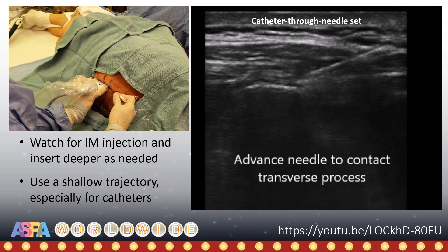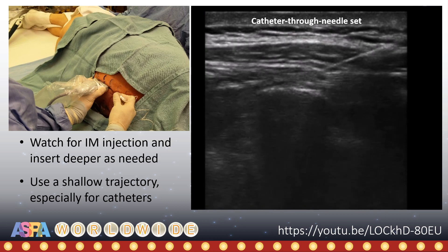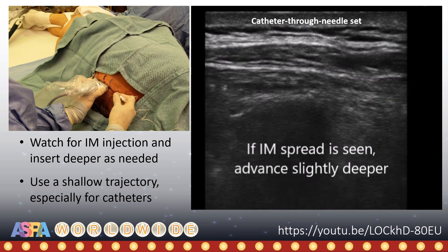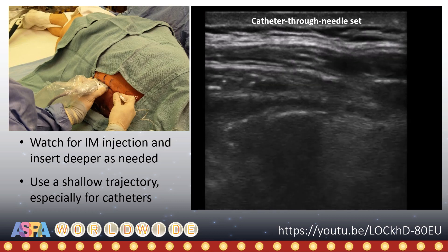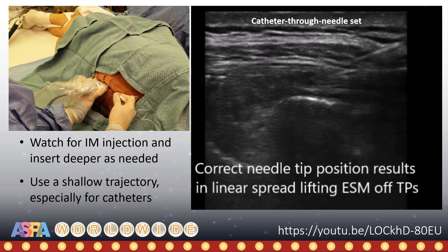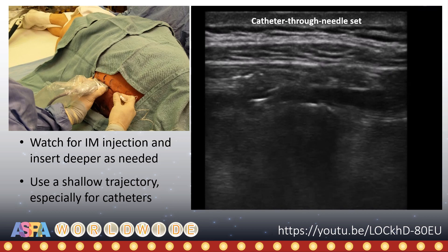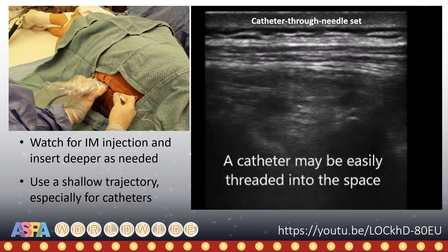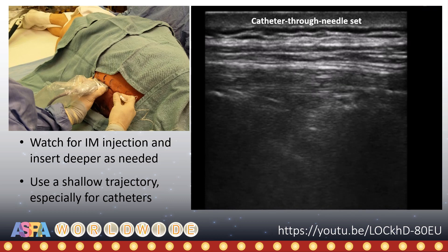Note how in thin patients, the muscle can be significantly compressed by probe pressure. As always, use hydrolocation and watch for intramuscular injection. If this occurs, insert deeper to get under the investing fascia and to obtain the desired linear spread that occurs in both a cranial and caudal direction and lifts the muscle off of the bony shadow. Once the space has been opened and the needle tip is within it, a catheter can be easily threaded in.